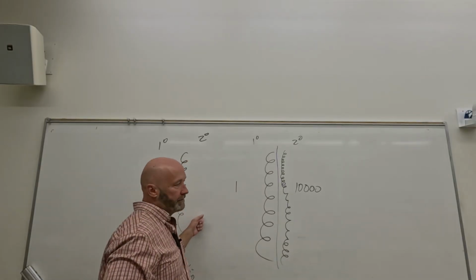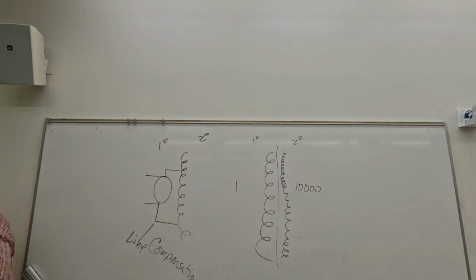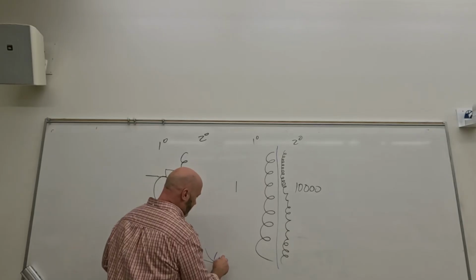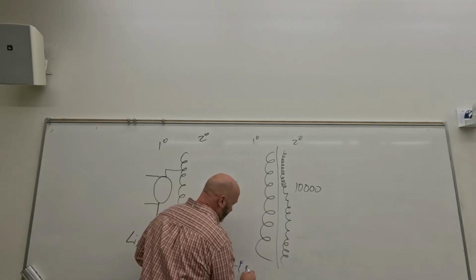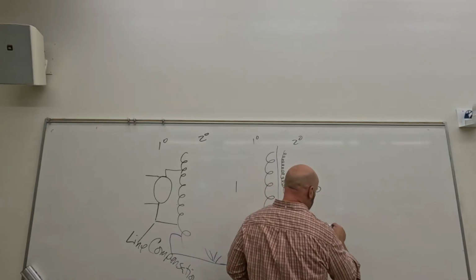Low voltage, high voltage. Notice also that as he comes down, a part of the filament circuit is in the high voltage section, right? The filament circuit comes off down there, it goes through the mA selector, and it goes into the step down transformer, and that in turn comes off and goes into the X-ray tube.